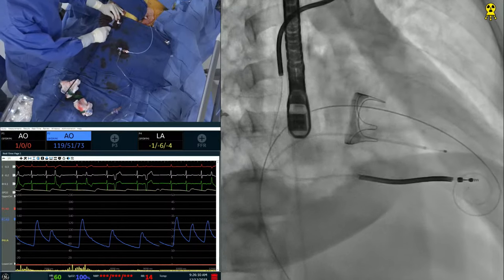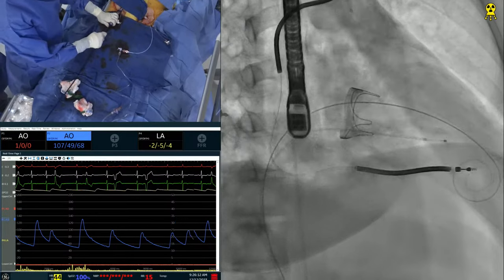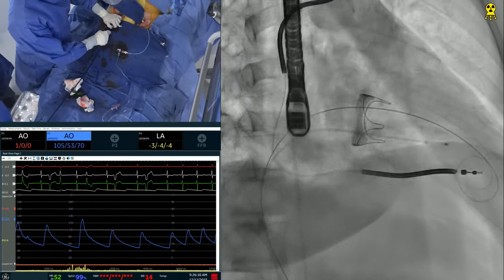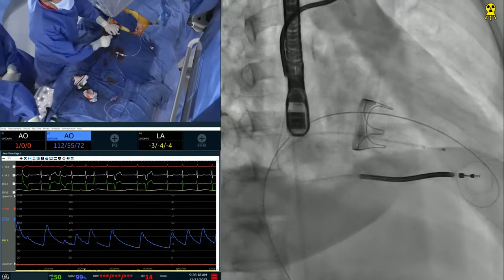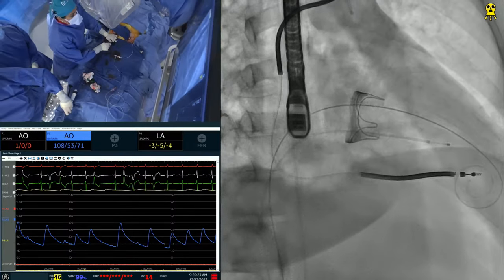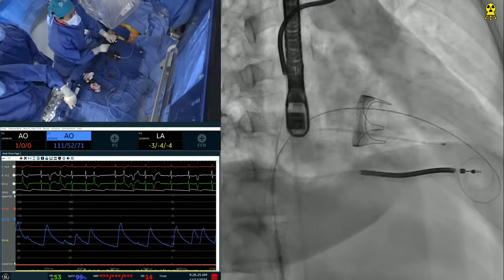And what about the Edwards E? Has to be facing down. Facing down. Yeah. So everything opposite. Usually we go up with the TAVR. Now it's down. And of course the valve has to be in the right way. And okay, stop now. Here.